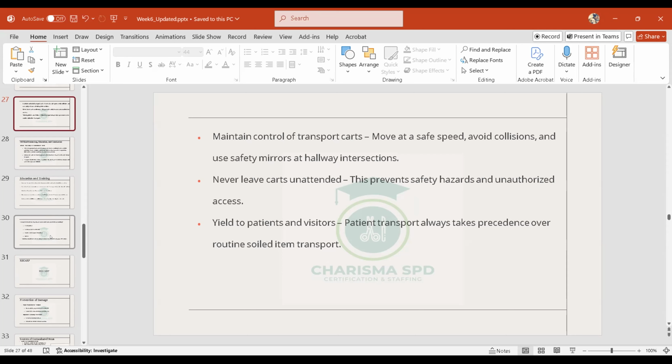Or this cart is contaminated, is carrying contaminated instruments, is dirty. What happens if this cart is left unattended, there's no communication on it, that is dirty, somebody touches it, it can bring about what? The person can be exposed to hazardous materials.